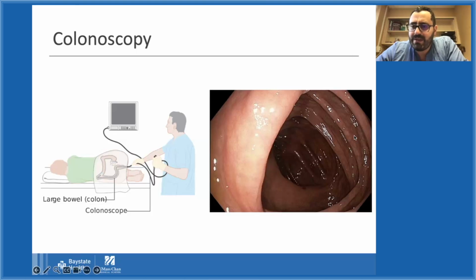So always, I tell my patients that small polyps can be hiding behind folds. For example, this is a fold, right? You can't see what's behind it, and that's when we can sometimes miss polyps. I always tell my patients that when I'm obtaining consent.